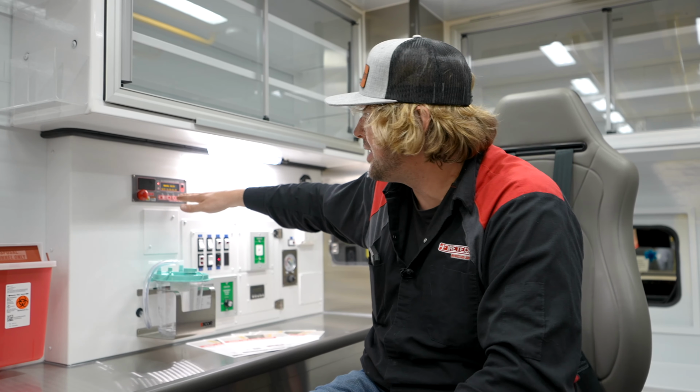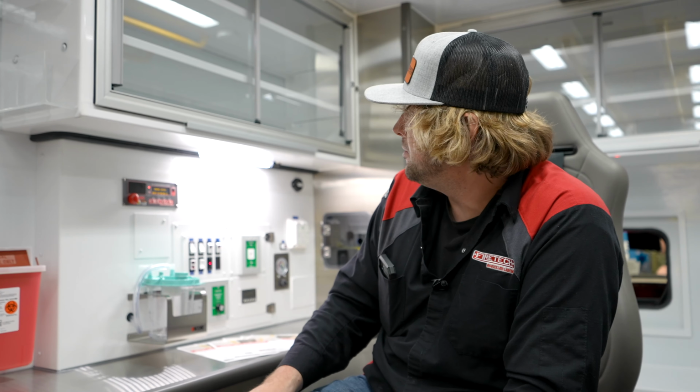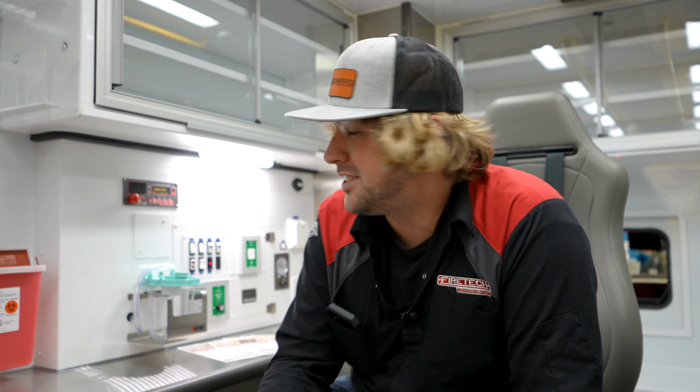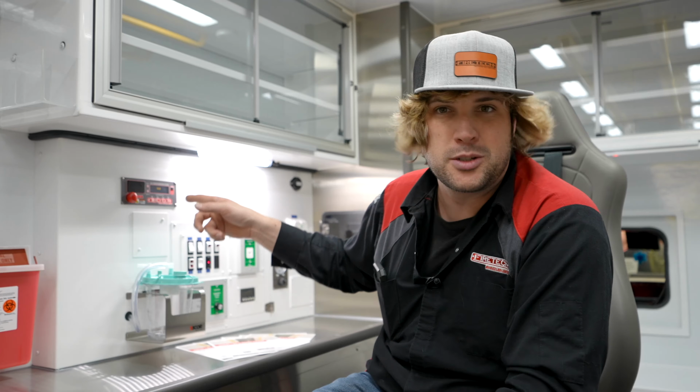But anyway, as it's counting down, the system will get down to a preset point where it will then check all the sensors and make sure the vehicle's safe, and either irradiate or it will go back to an idle state because the vehicle is occupied. I'm gonna let it go through this countdown real quick and I'll show you what happens. At 10 seconds, it says decontamination will begin in 10 seconds. And then when it gets down to 0, what's gonna happen in this video is it's gonna say, truck's not safe because I'm in the back and I'm triggering this motion sensor, I'm triggering the weight sensor, and the doors are open. It goes back to idle. That's a safety feature to make sure it doesn't come on while you're back here.